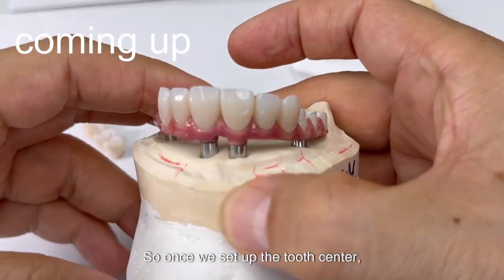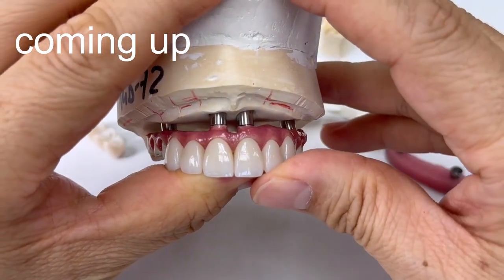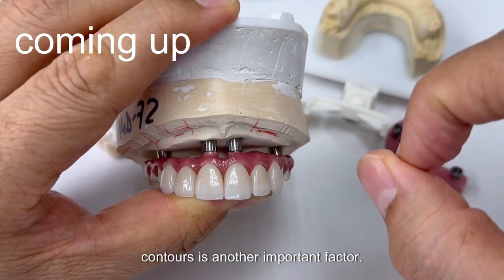Once we set up the tooth central, which is very imperative, we make sure the good proportion of the tooth. Then the laterals — we move it, and second, we have to know the tissue contours, which is another important factor.